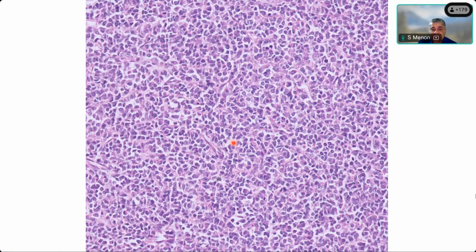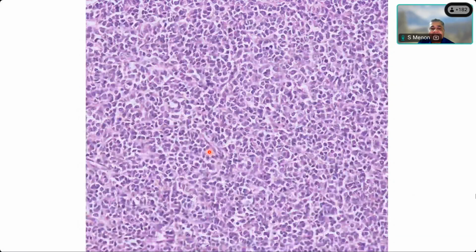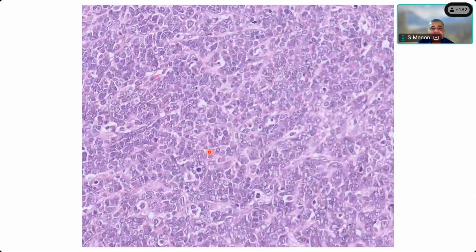Somebody thinks it's a granulosa cell tumor. Shweta did say it can be a juvenile granulosa, but look at the sheeting pattern. It's completely sheets, and there are some punctate blood vessels in this. And it's a blue-looking tumor. It does give you a feeling of a round cell tumor. Somebody called it a non-Hodgkin lymphoma. Does anybody think it's an Ewing sarcoma or a rhabdomyosarcoma? Tapamita says it's immature. So do you think it's an immature teratoma? Is it neuroepithelium? No. Yeah, this picture is better.